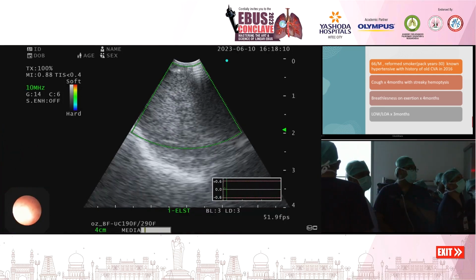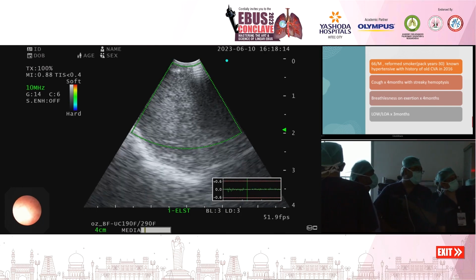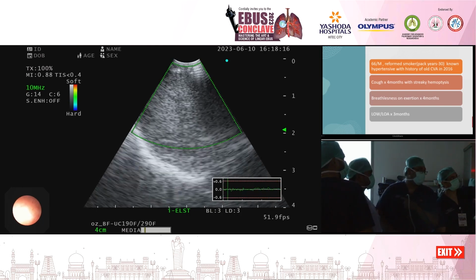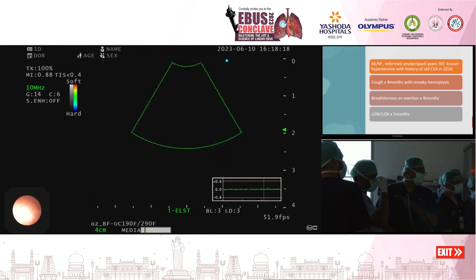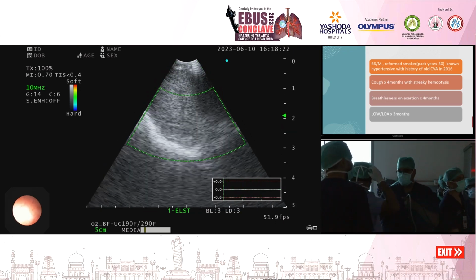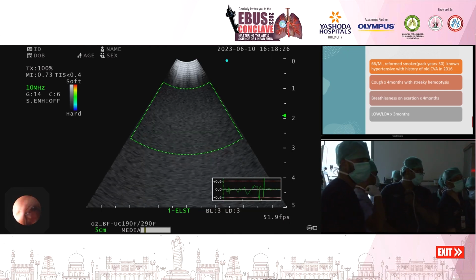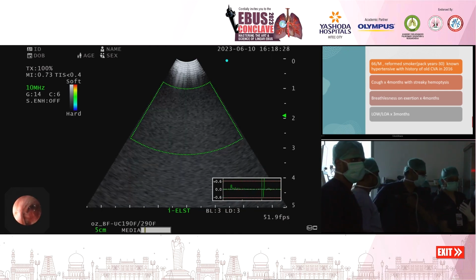I would request Kedar, Val, everybody to call them. So the third case is a case who has been referred for diagnostic EBUS. He has a large paratracheal mass. So we have already shown TBNA, so we won't be showing it again. The intent of this case is to show the newer techniques in the EBUS, in the new EUME3 processor.